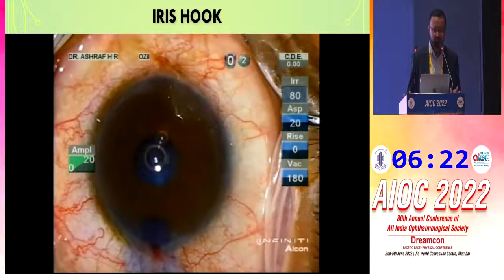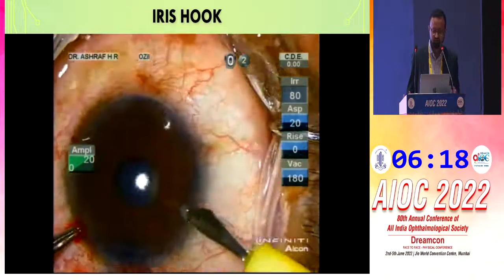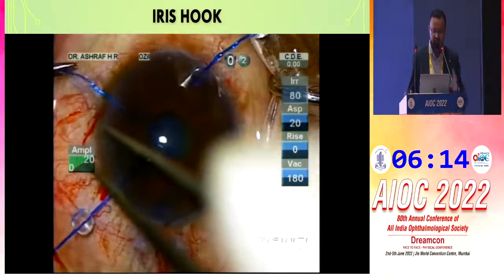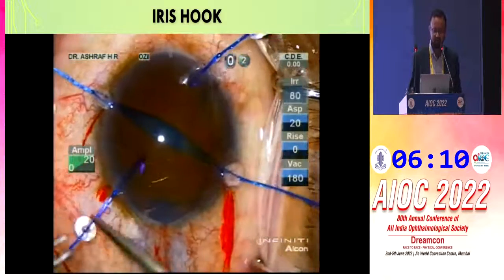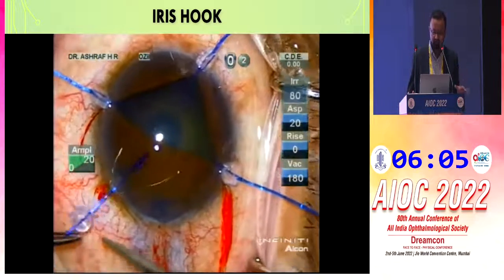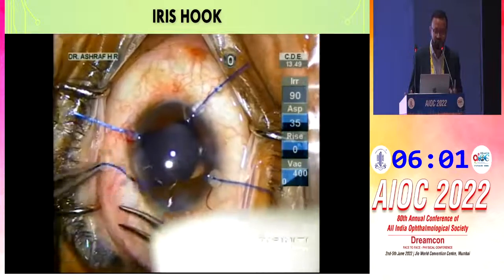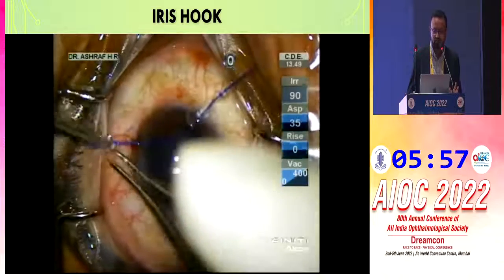In Bangladesh, we most commonly use the iris hook. After staining the capsule, we fill the anterior chamber and below the iris with OVD, then make four small paracenteses at 2, 4, 8, and 10 o'clock near the limbus. Hooks are inserted carefully to avoid touching the endothelium and the capsule. One additional hook can be placed under the main incision to allow easier instrument entry.